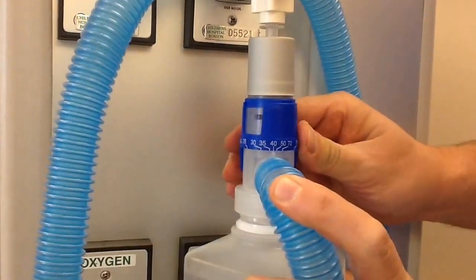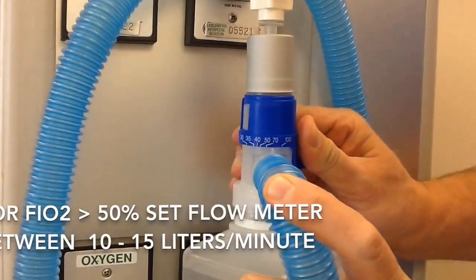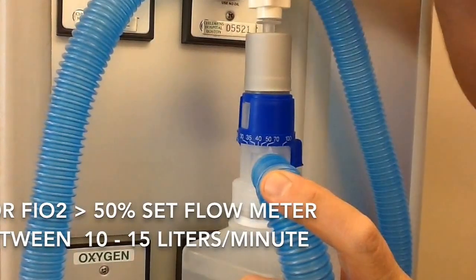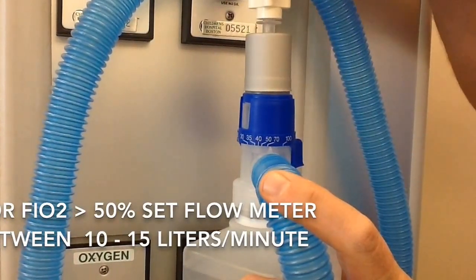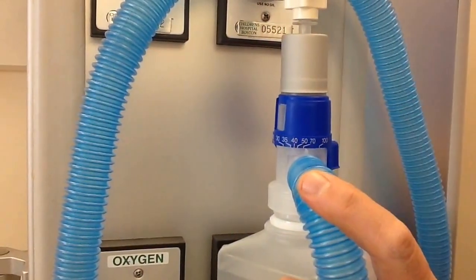Now as we turn the dial past 50%, we're at approximately 70% FiO2 right now, we need to increase the flow. Anything above 10, so between 10 and 15 liters per minute for FiO2s greater than 50.